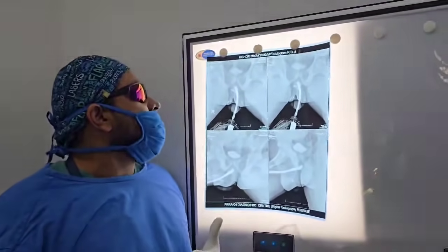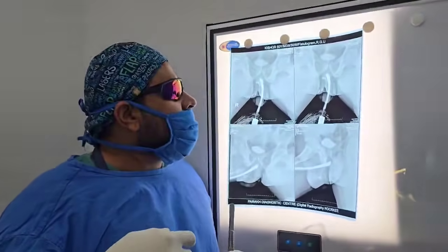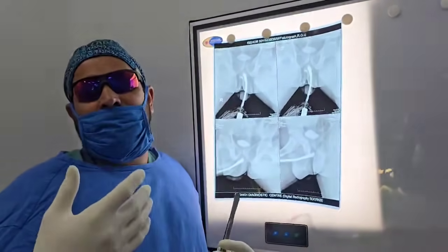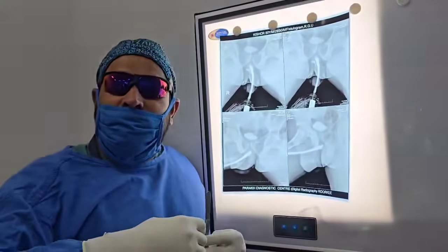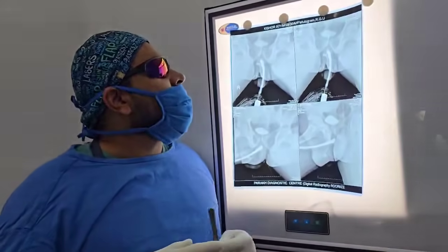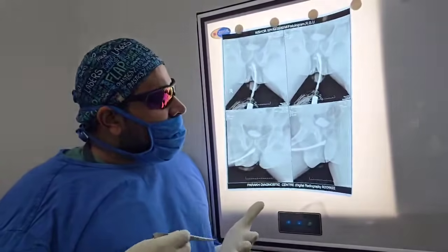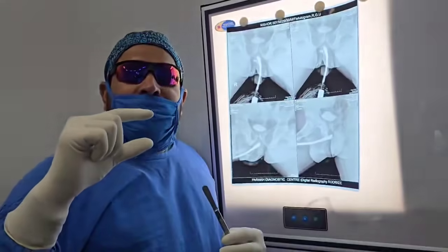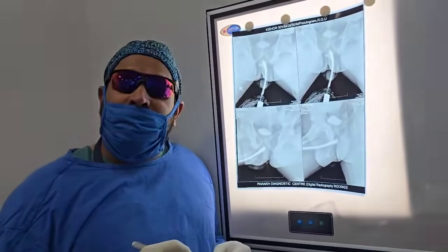Number three is the track which is at 1 o'clock. Again, in that track I will also go through with the laser, do the curettage, and do the laser ablation again. When both the tracks are open from both sides, finally I do the marsupialization of that Troppis area. Then I will do the coring of the upper tracts, and it will shorten the time of the therapy and cause minimal injury to the sphincter. So this is again Dr. Sachin.